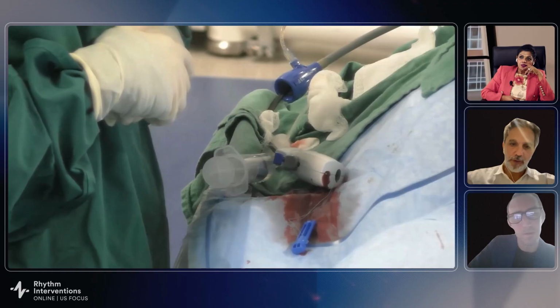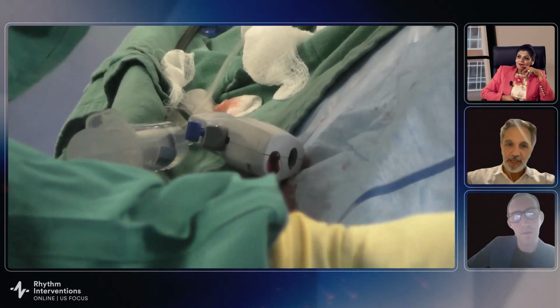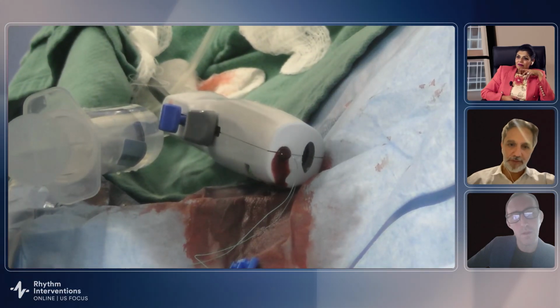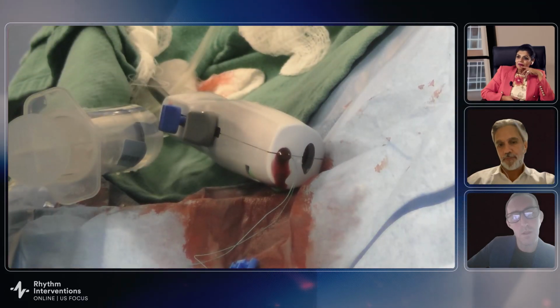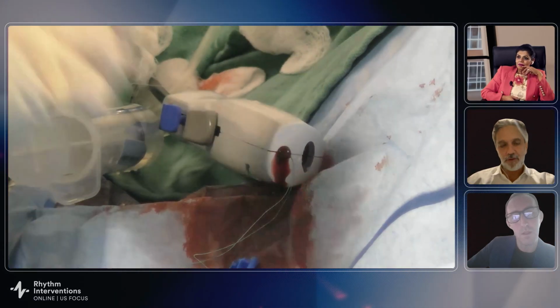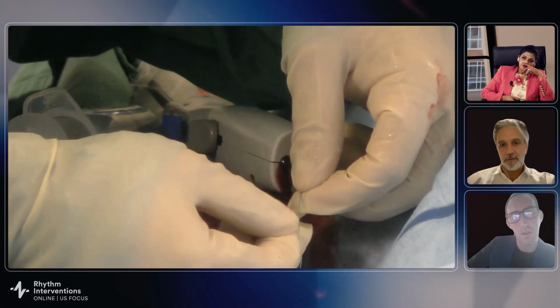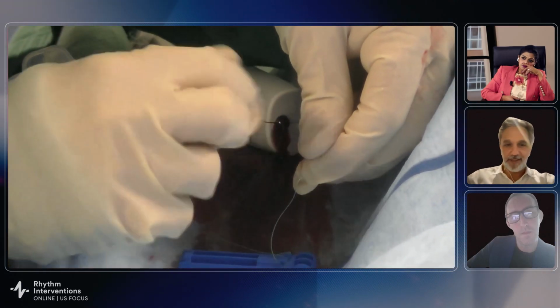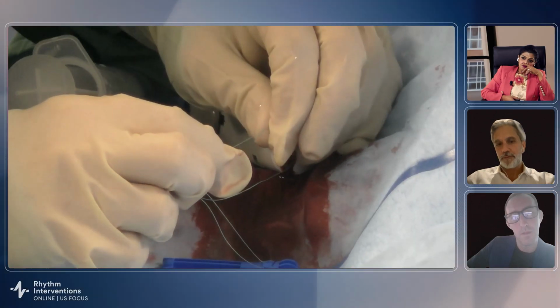Here we're showing, when you have good contact, it's like anything, like a Watchman. Even when you see this bouncing back of the tethers, it's a good sign that you have good contact. Threshold is 0.38, so we're ready to release. One time the sheath slipped down, but luckily nothing happened. Okay, cut it.